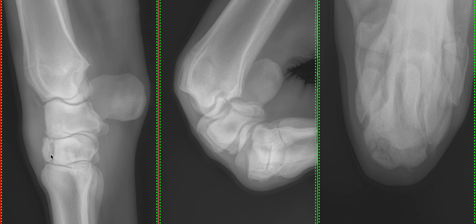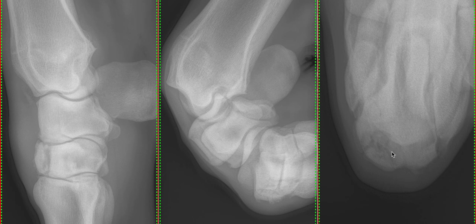We can see that the fracture line is wider proximally than distally, which indicates the fragment is marginally displaced dorsally in its proximal aspect. This line isn't particularly well-defined, and on the dorsoproximal-dorsodistal oblique view it's a little bit ill-defined and blurry. Given this horse has had a four-week history of lameness and swelling, that probably fits with some lysis around the fracture line. We can see the fracture really well on the lateral medial view and also on the dorsoproximal-dorsodistal oblique view, going through the medial portion — or radial facet — of the third carpal bone.